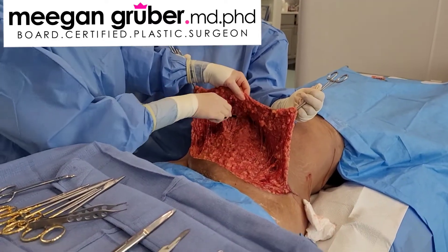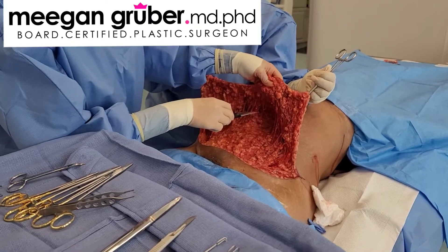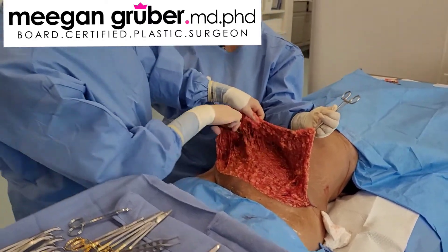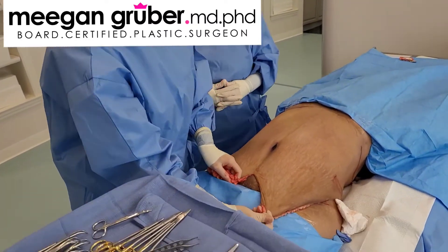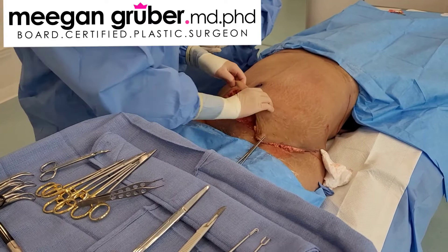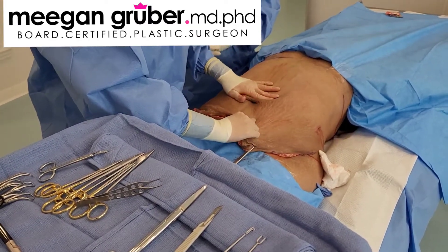It's just like when we do a facelift — you just kind of undo the fibrous tissues and push your scissors forward. The mobilization is almost completely up to the belly button, and now I'm going to disconnect that so we can pull it down even further to get all this part out.